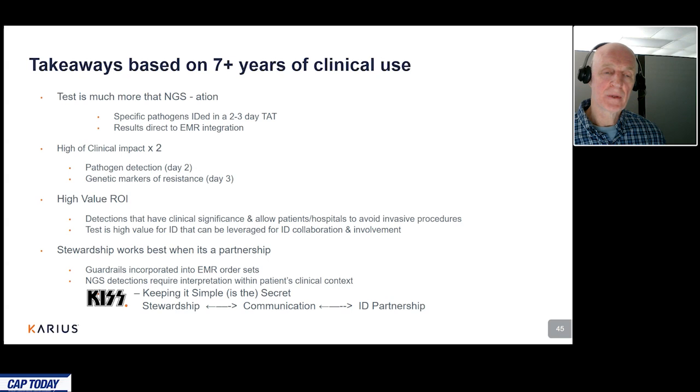And we would then be responsible for the bioinformatic interpretation. Obviously, as you saw, having the organism detection to the species level in less than 48 hours is impactful. We in the lab appreciate that it's integrated into the EMR, saving us phone calls. The providers appreciate that as well, not to mention that they can lean into the genetic detection of antimicrobial resistance markers to guide therapy.